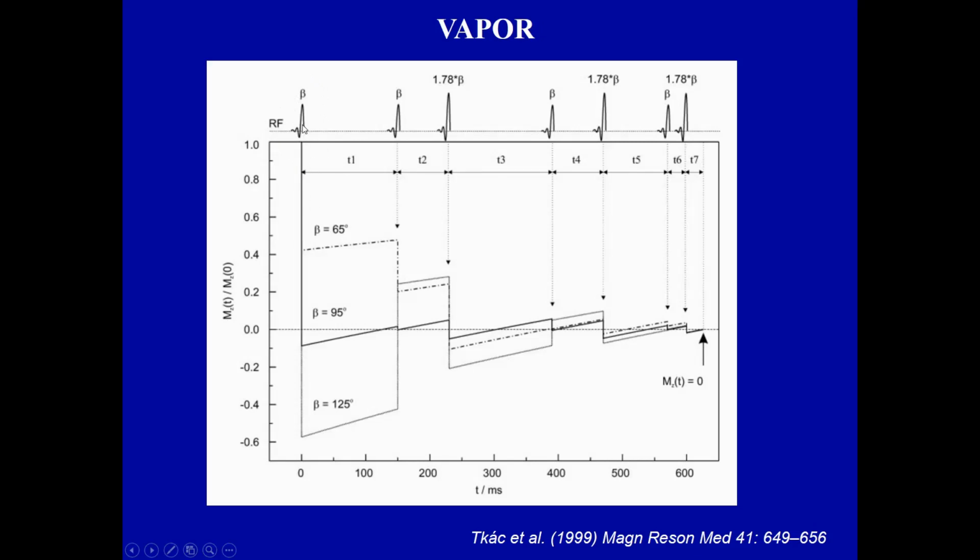It's a series of pulses applied with specially set timings, and the pulse amplitudes are set relative to one another. The timings are based on the T1 relaxation of the material you're trying to suppress, say, water in gray and white matter. And so if you want to run this in a tissue that has different T1s or different magnets, you're going to have to adjust the time delays between the pulses to whatever value is appropriate for the T1 in whatever system you're working on, whatever material you're using.